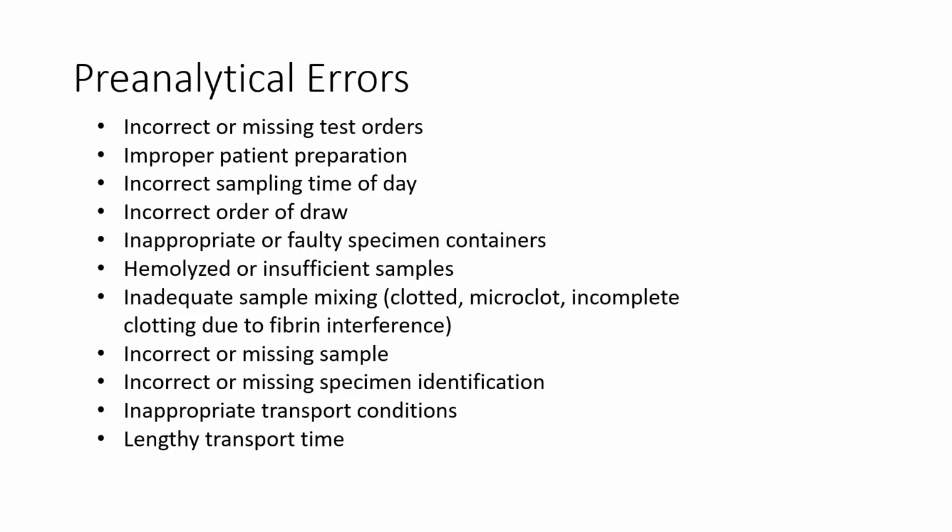Doing those simple steps may seem like it wastes some time, but it really does decrease the incidence of incorrect or missing specimen identification. Just getting that in the routine of the phlebotomist, to make sure that that's accurate.